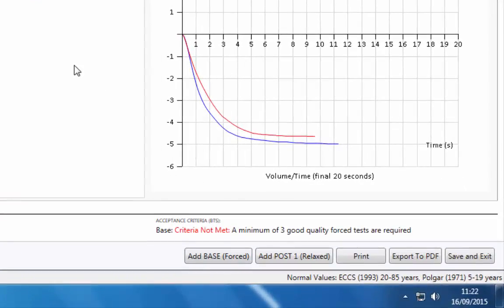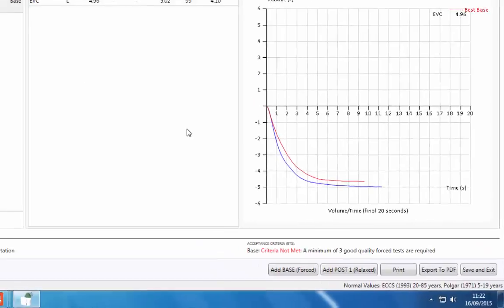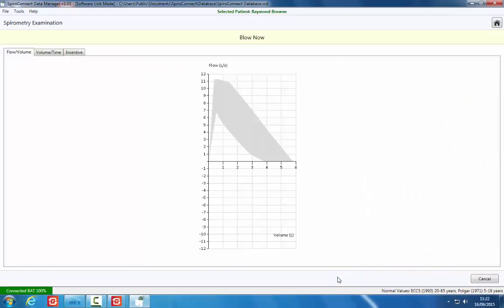Click the Add Base Forced button to begin the forced tests. The SpiroConnect will beep and the indicator light will go green. The flow volume graph will be displayed.